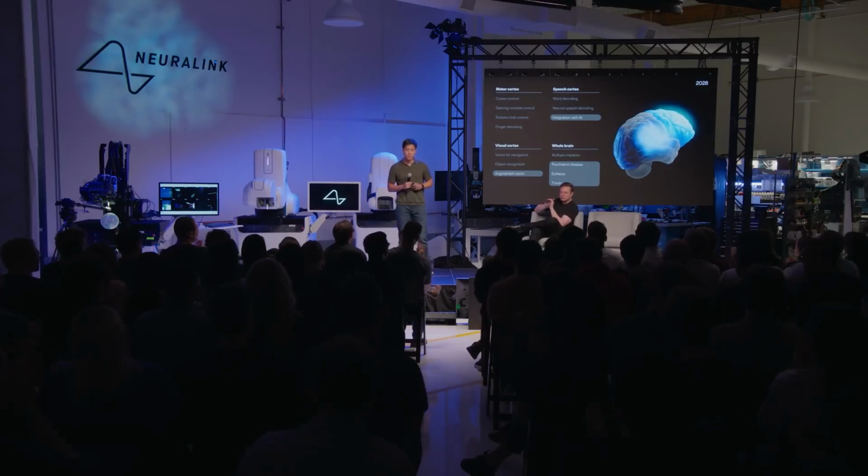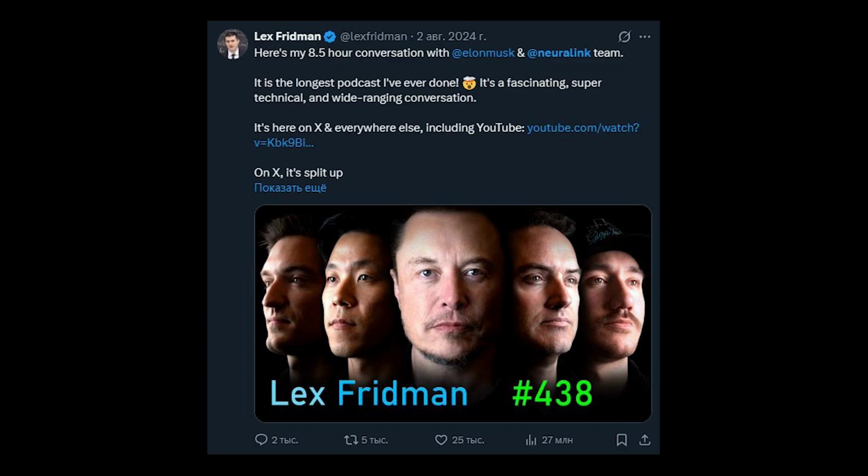Second, safety. In his 8.5-hour interview with Lex Fridman, Neuralink's co-founder and COO talked about how the device is already at a good safety level. First, the FDA watches them extremely closely. They obviously don't want some random tech implanted into people's brains. So standards are very high, and they haven't seen immune reactions to the threads.